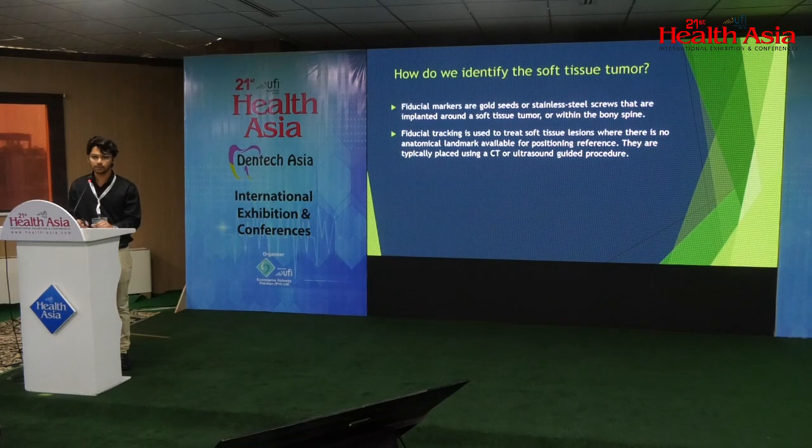To track the patient, we use fiducial markers, which are a type of pure gold markers or stainless steel screws. These objects serve as a reference to track the tumor because in Cyberknife we use X-ray imaging, and in X-rays we cannot see the soft tissue tumor.